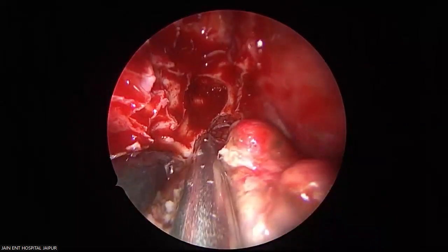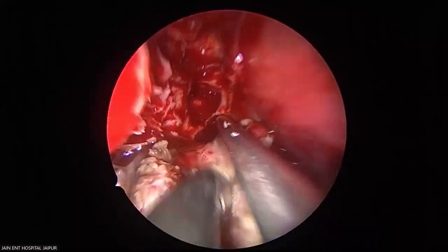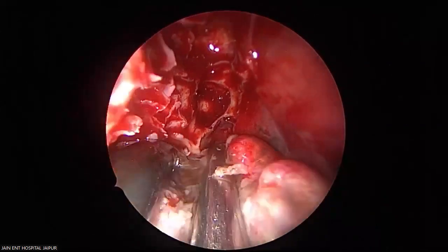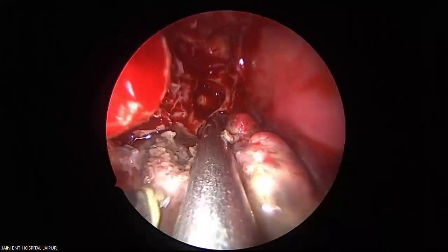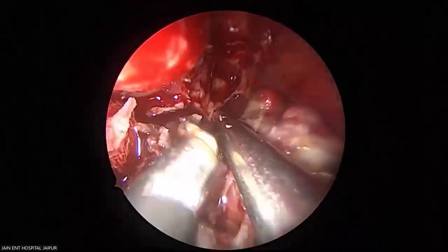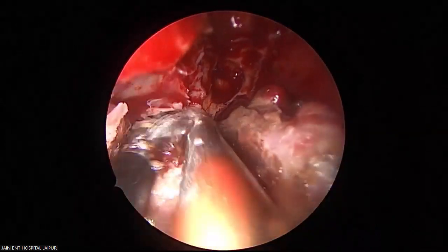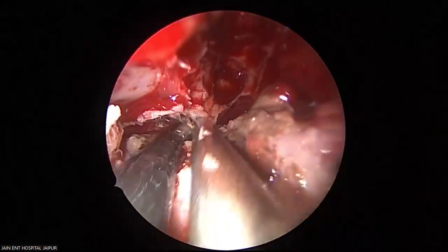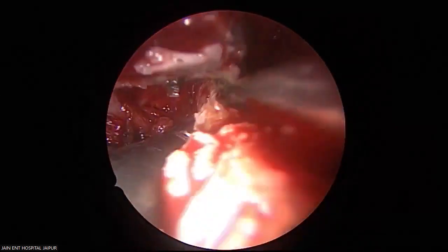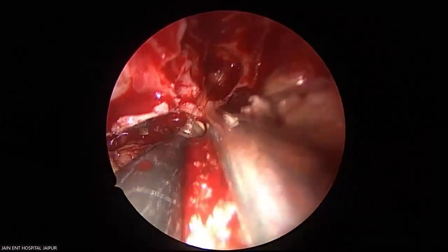See the entire superior surface very distinctly. Is that clear? Your coagulator is the key. See the superior surface of the tumor? Very clearly.